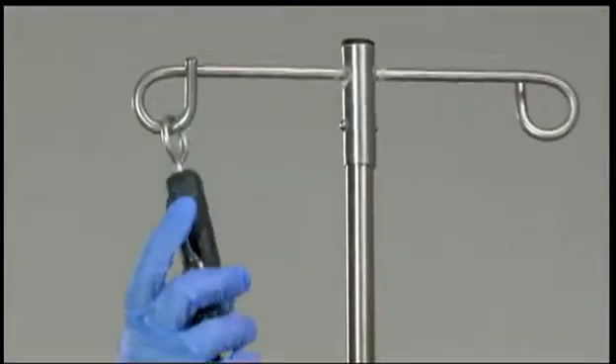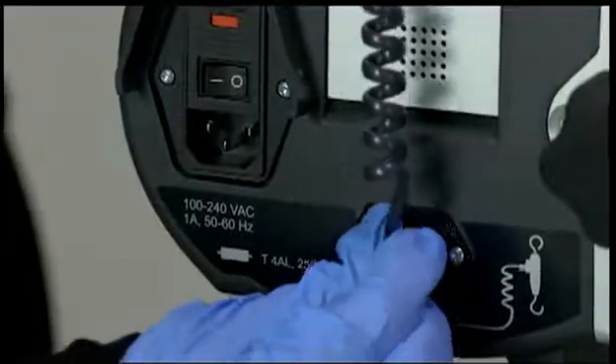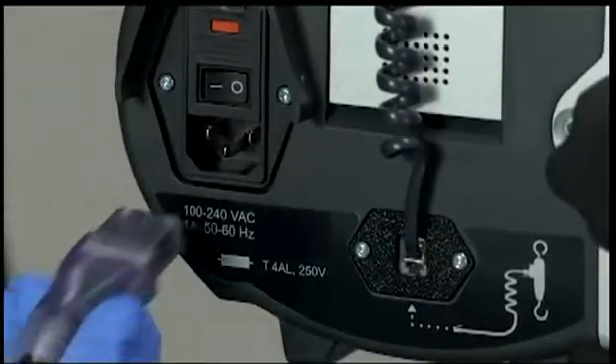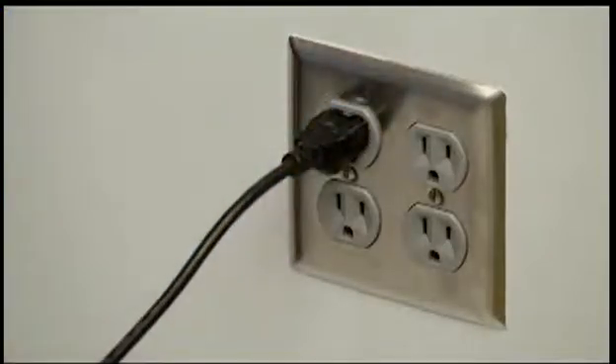Hang the low saline level sensor from the horizontal arm of the IV pole. Plug the low saline level sensor connector into the back of the pump. Verify that the power cord is connected to the back of the pump and plug the power cord into a properly rated, hospital-grade power outlet.